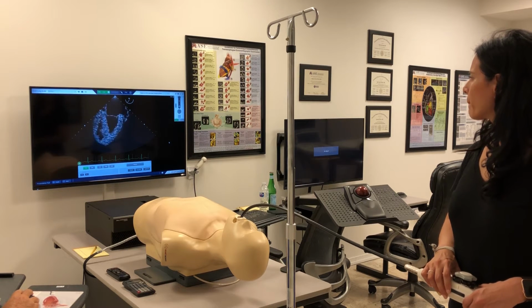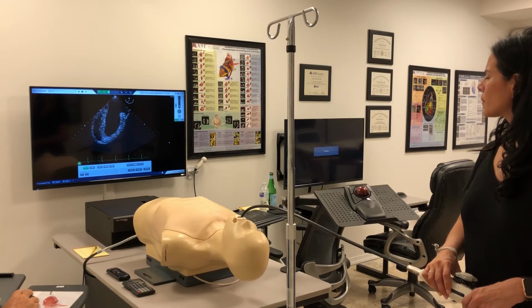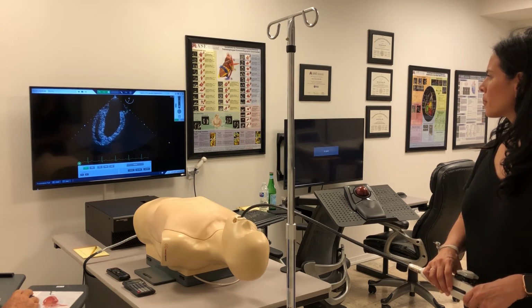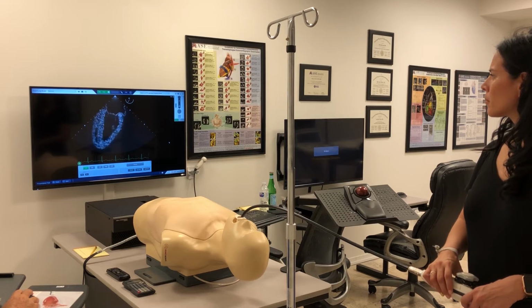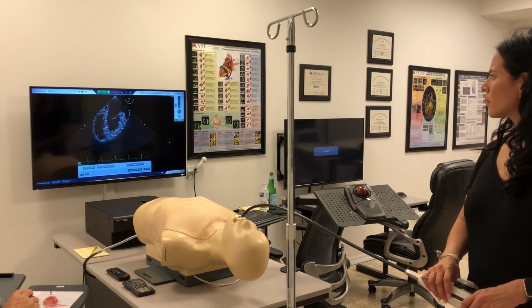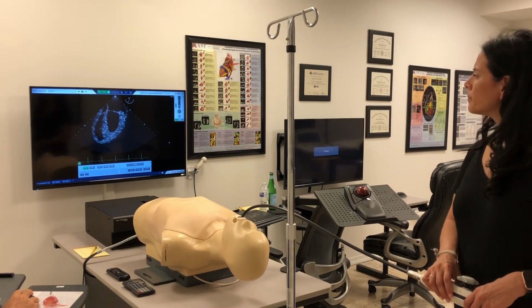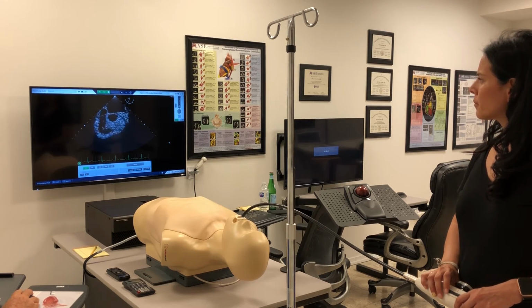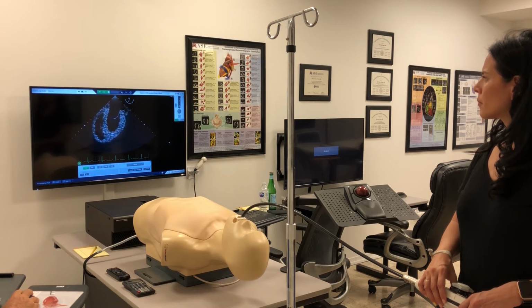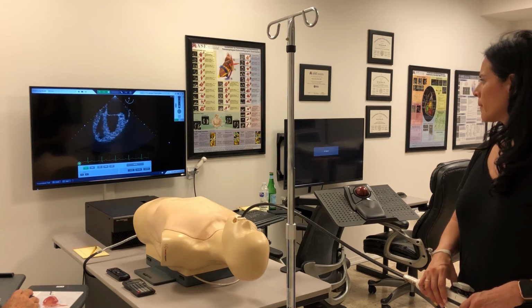There. And I refer to this as growing the appendage with the omniplane. Maybe a little bit more, see how it's more robust. Then when you think you have it full, to make it even fuller, you can scan left and right to make sure that you're on the largest volume of the left atrial appendage. Also, you're inspecting it for clot. Instead of cutting a single plane, you're cutting an infinite number of planes looking for sludge or clot, both of which can cause a stroke at cardioversion or at cryoablation.